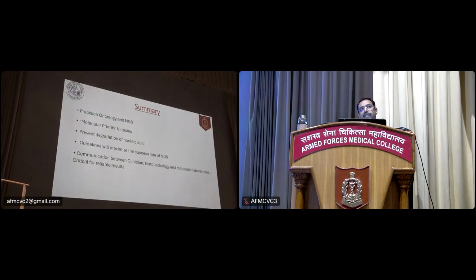One of the reasons that the turnaround time is not being met presently is because different tumor sets are coming at different timelines, and the first sample that came essentially, we can put minimum 8 samples in one run. So to accumulate those 8 samples, it is taking some time. But once the sample load increases, I think the turnaround time will be met.